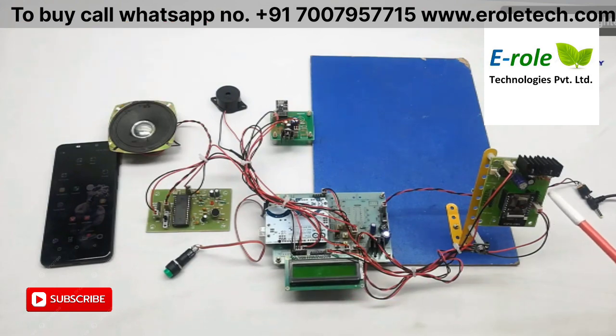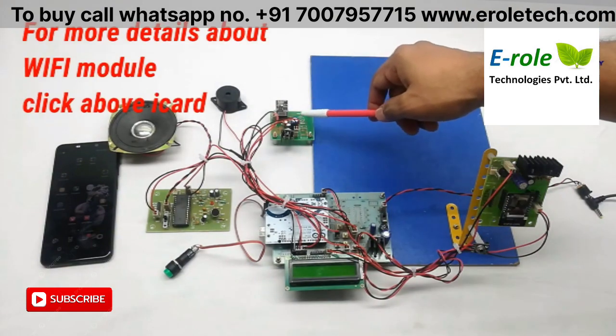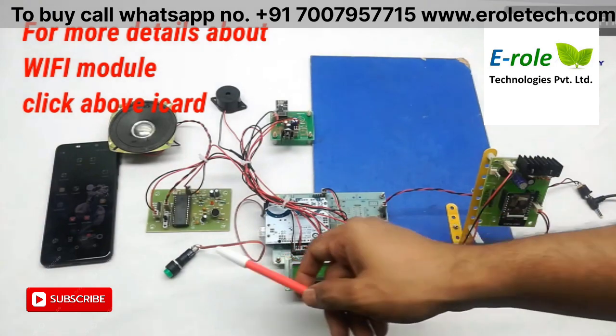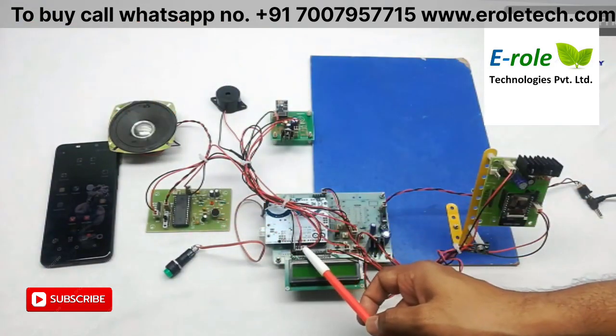ESP32-CAM and its baseboard. Here, ESP32-CAM is placed on its baseboard. It has all digital pins and it has a 5 volts DC supply connected to ESP32-CAM. Here, the contactless temperature sensor MLX90614 is connected to Arduino I2C pins. Wi-Fi module ESP8266 is connected to Arduino UART port. Here, switch, buzzer, and APR voice module are connected to Arduino digital pins respectively.